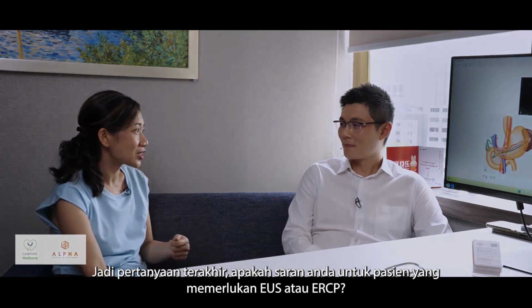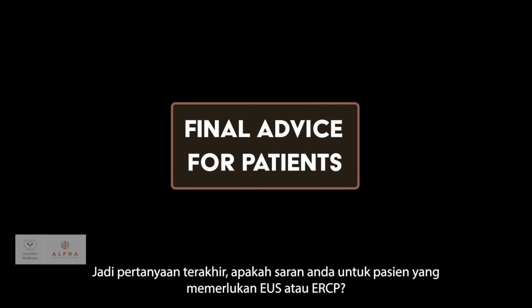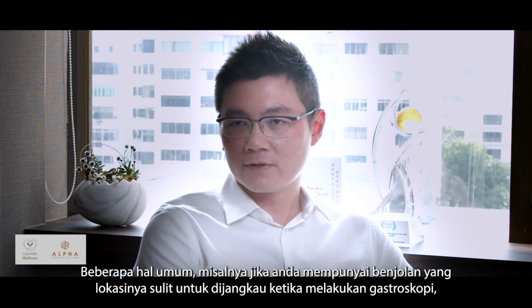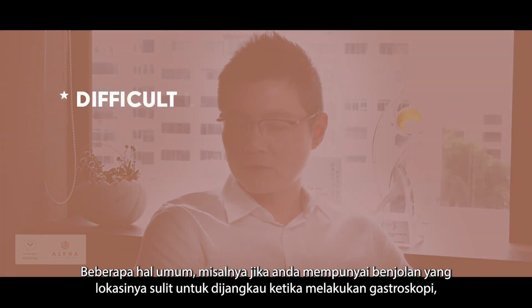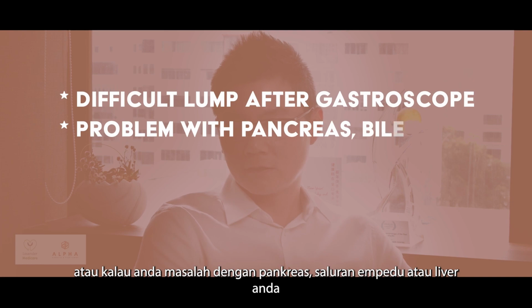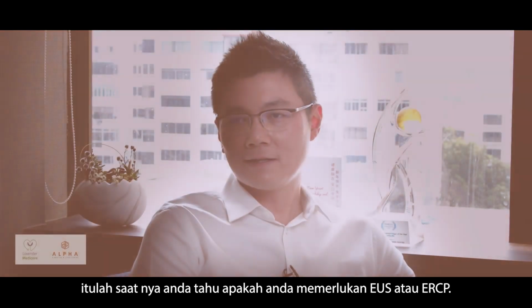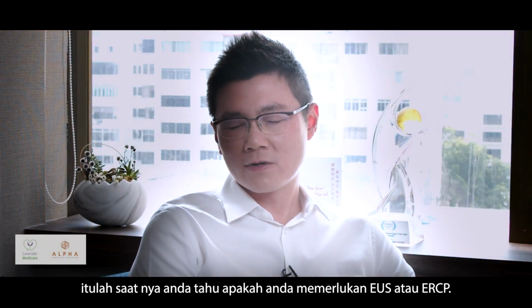So last question. What is your advice for patients who need to do EUS and ERCP? A few common things, let's say when you have a difficult lump when a doctor does a gastroscope, or you have a problem with your pancreas, your bile duct or your liver, or you've got a problem in your plumbing, so in your bile duct or your pancreatic duct, then that's when you know you may need an EUS or ERCP.